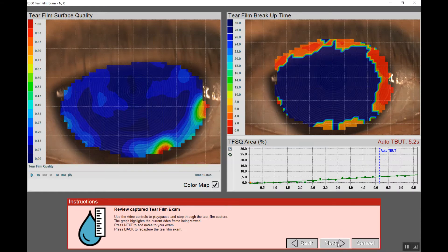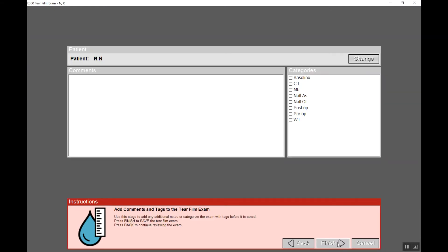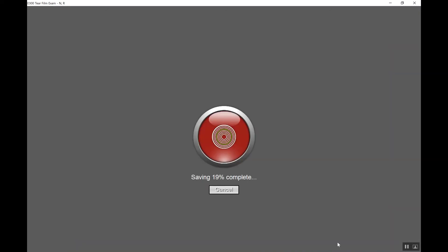Clicking the right arrow, we can add any comments to this field that will show up associated with this specific test. If we're happy, we can click finish.